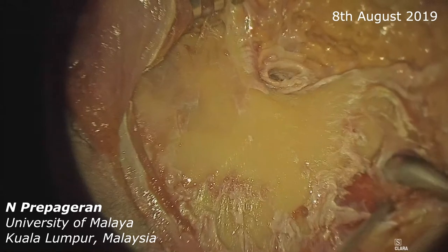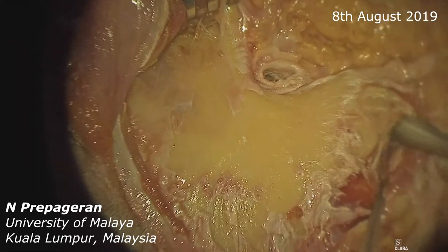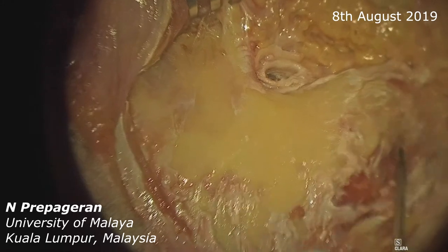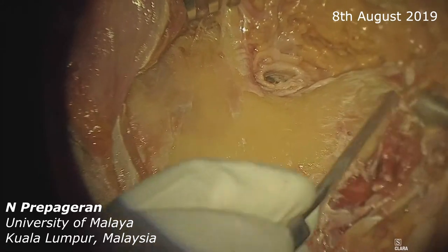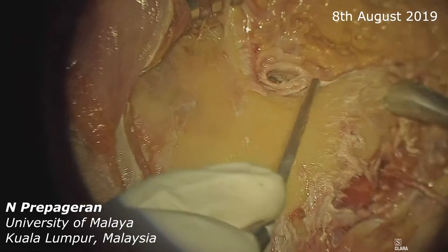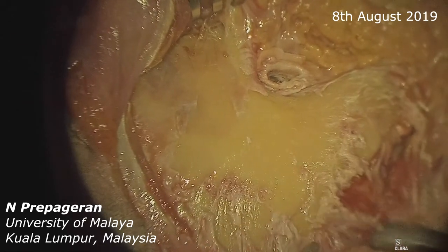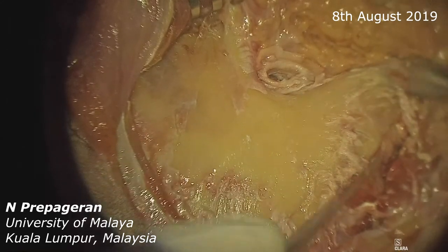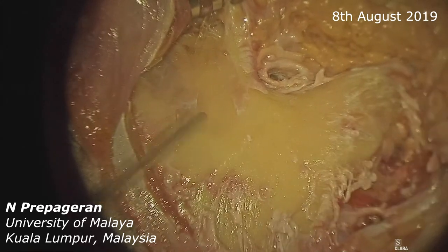So now you are able to see the digastric groove and the digastric muscle. The reason why you need to do this is so that we can drill off the mastoid tip later as required. If you remove all the periosteum here, the surgery will be much easier.